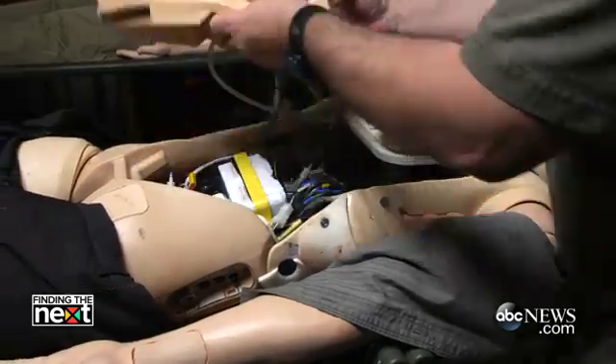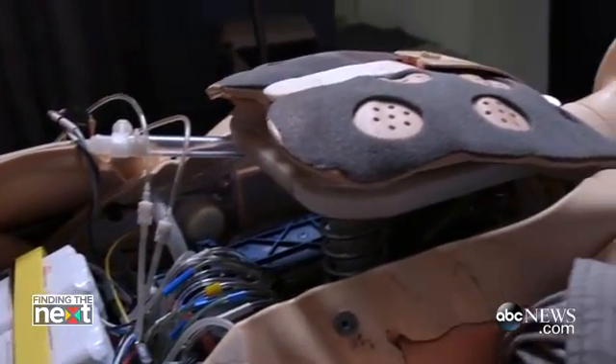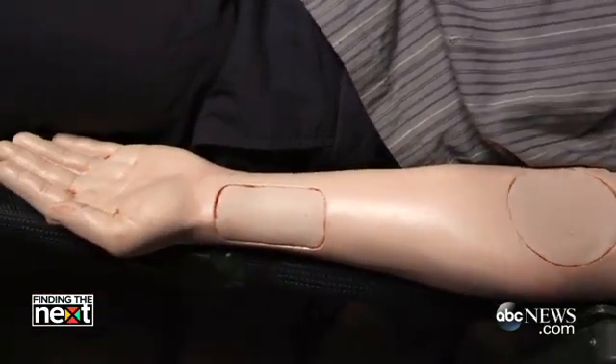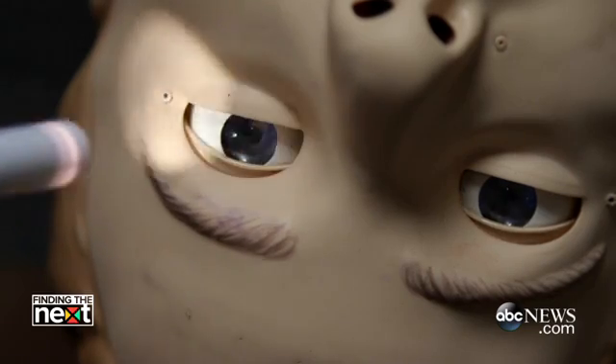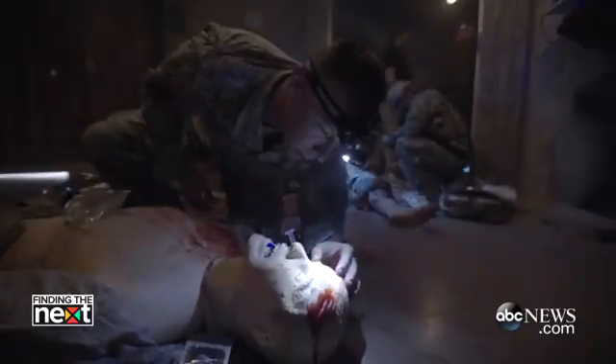It's about $90,000 worth of computer within these mannequins. They can breathe — they're pneumatic, so their lungs can inflate with air. Most of the pulses you can find on a real person, you can find on these mannequins. Their pupils react to light, so you can put a pen light in the eyes. The evaluator can simulate dilated or constricted pupils — unequal pupils suggest a possible head injury.